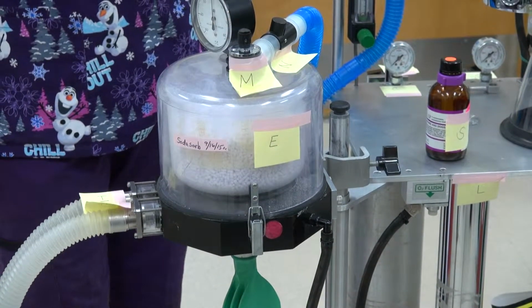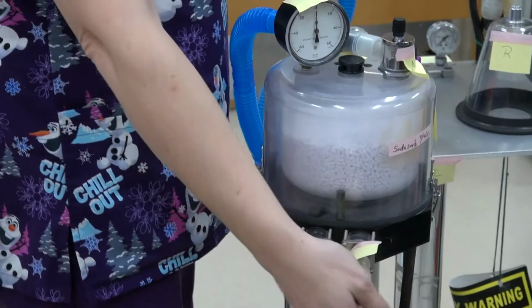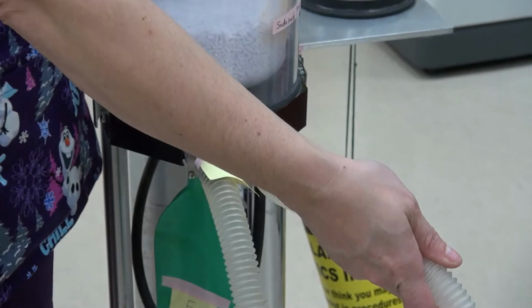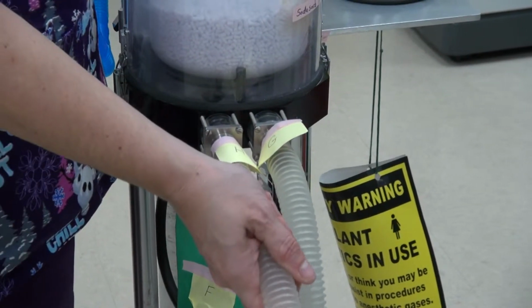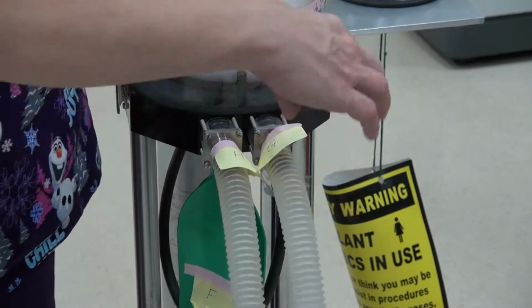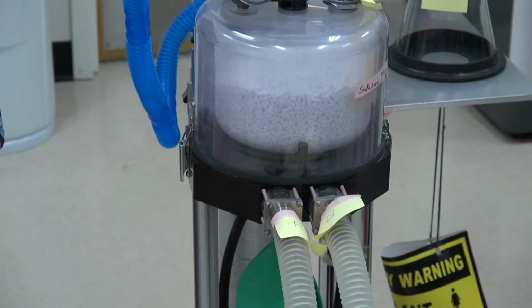What's G? Inhalation. Here's G right here. Right, this is our inhalation tube. And then what is H? Exhalation. And that's our exhalation tube. So it's going in, going out, okay? What is I?